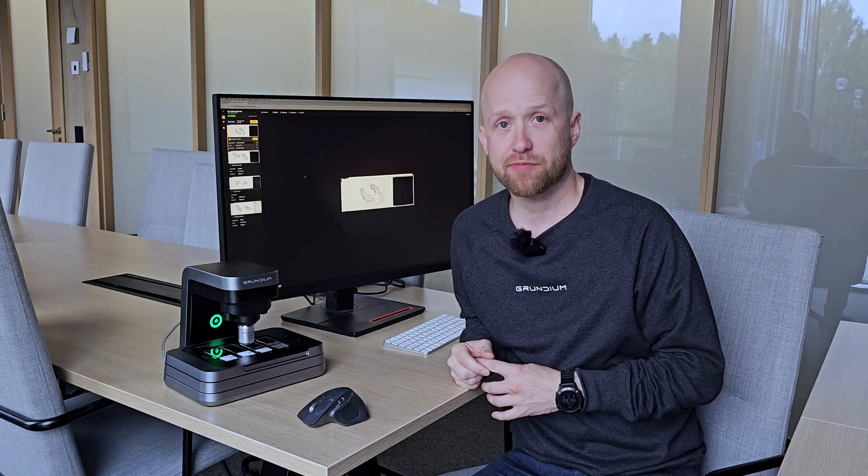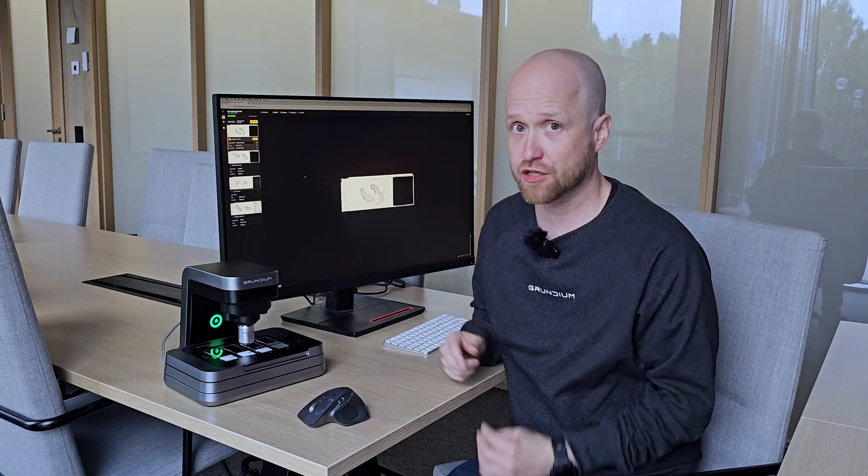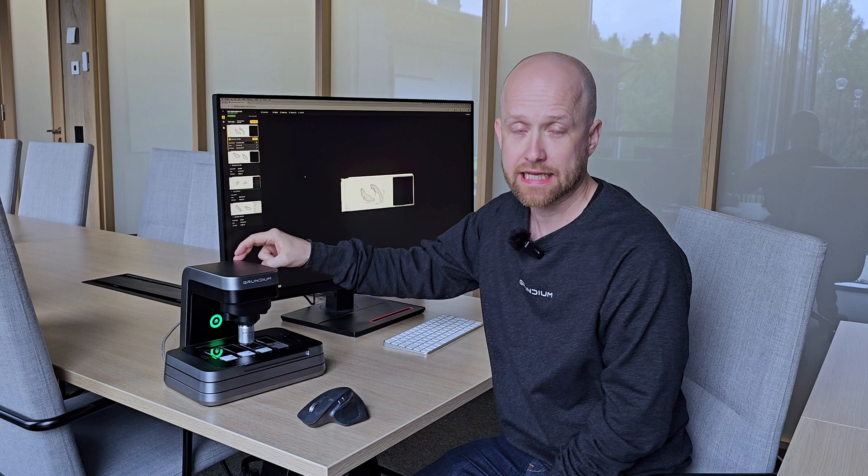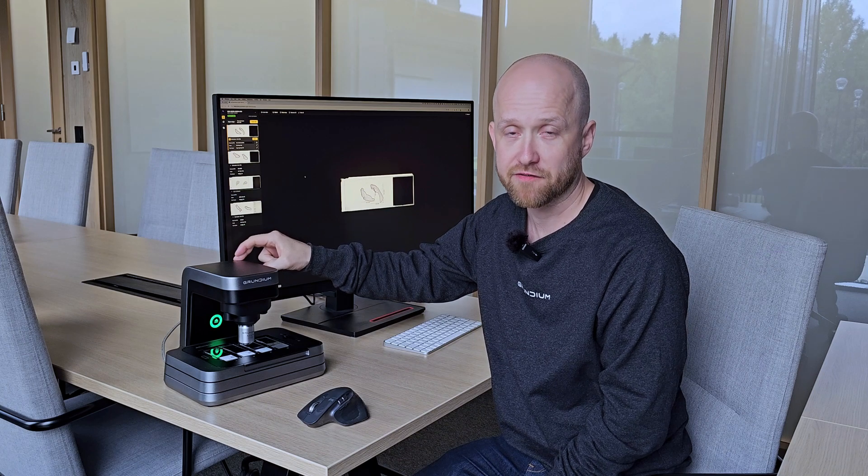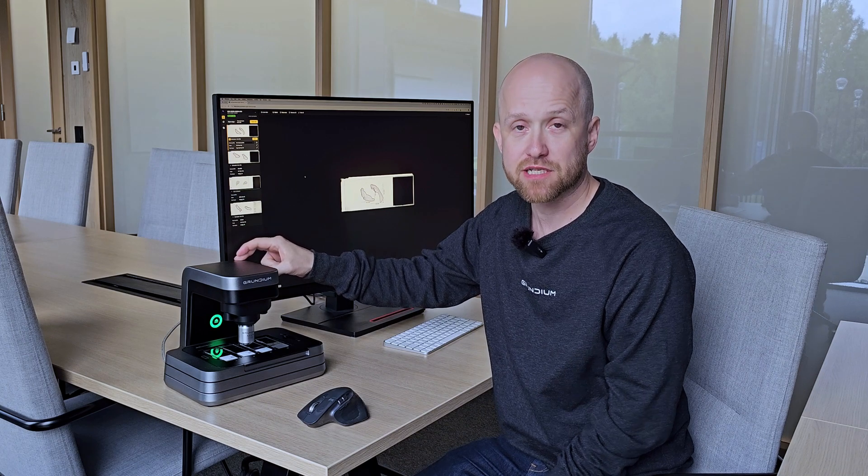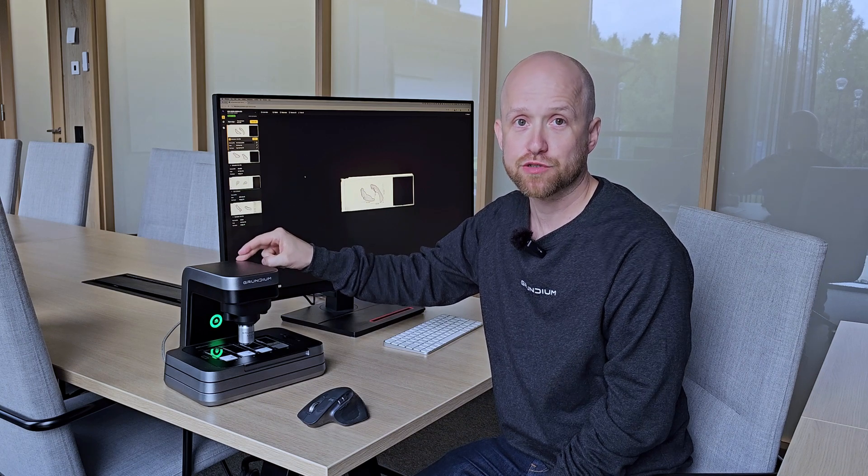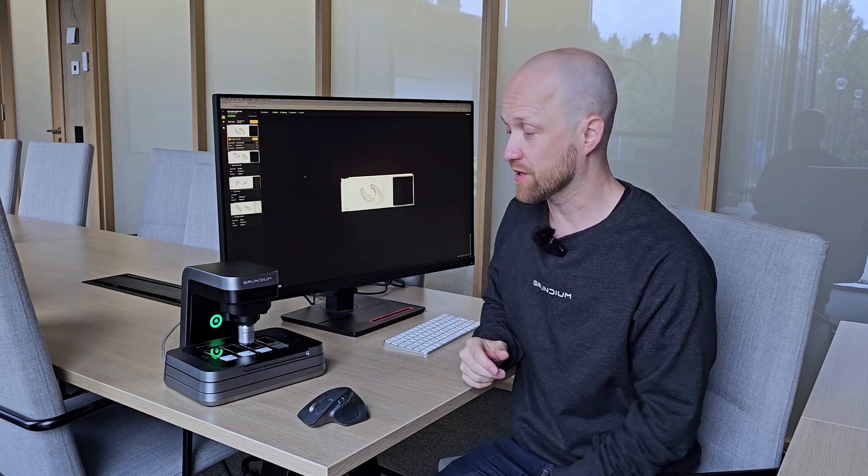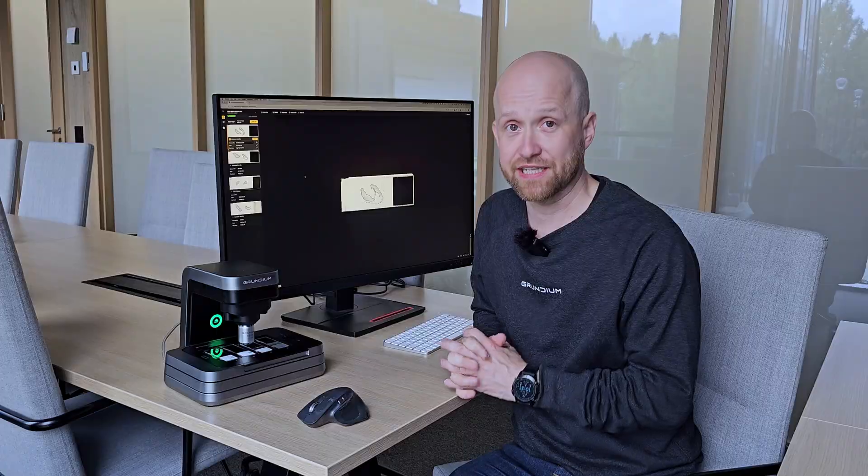Just like before, the scanned images are stored in the scanner itself. The M system has two terabytes of storage, so that's going to hold plenty of images.